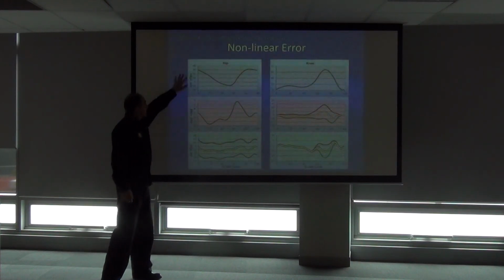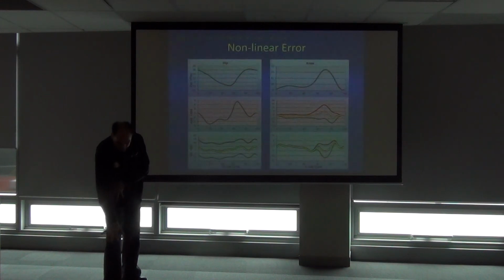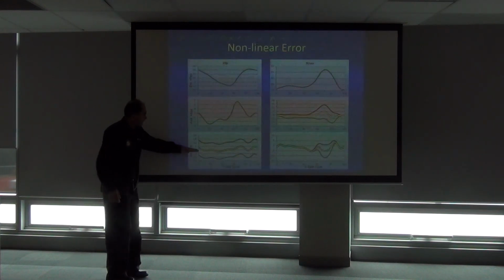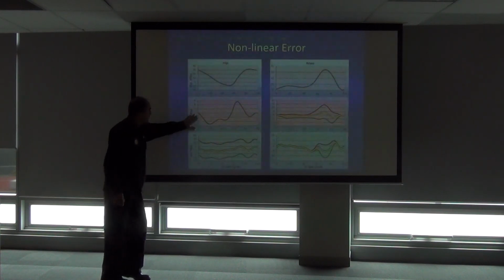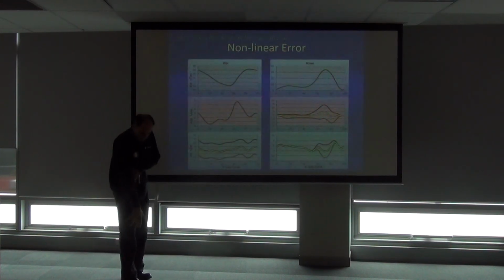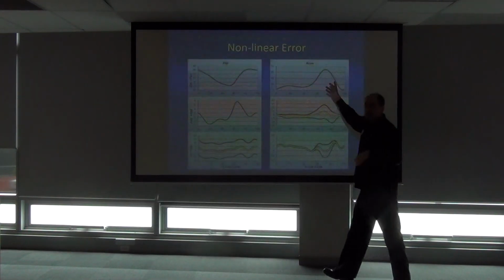So here it is. It hasn't affected hip flexion extension and adduction. We've twisted the knee rotation when we analyse it. And here we see hip internal external rotation, plus 10, minus 10. There's the original, they have changed. The original is through here, offset of the thigh, plus 10, minus 10.